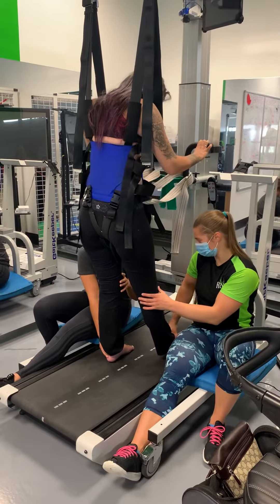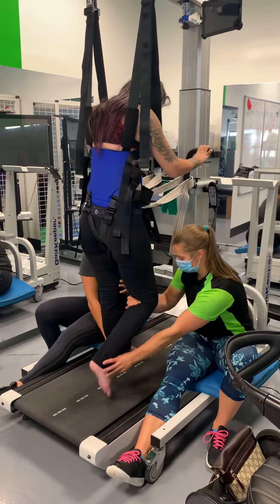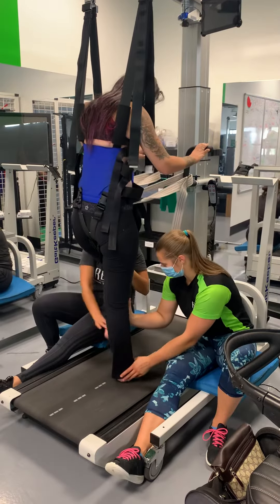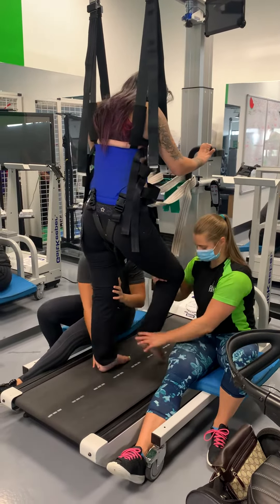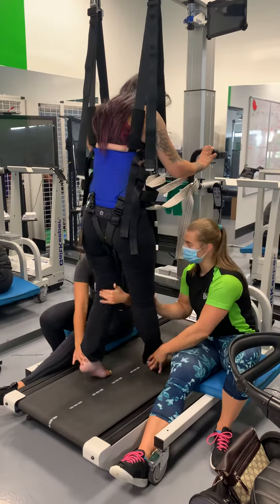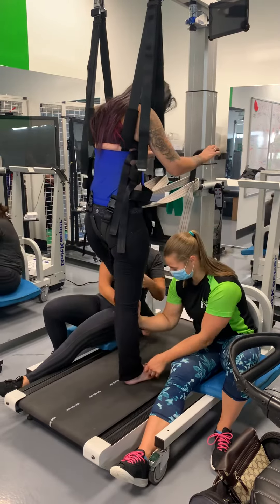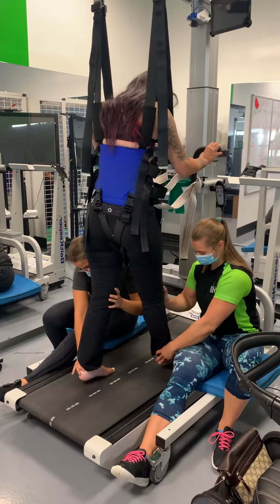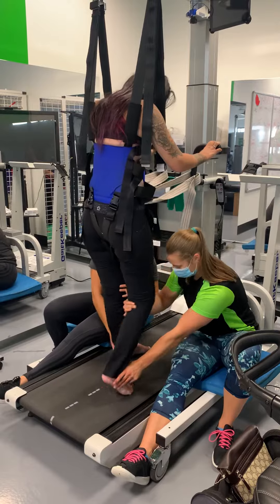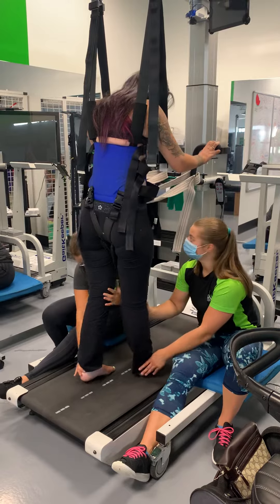So, slow — you're going to push it first and pick it up. There you go. She should be fairly easy. How are you doing up there? Stand up. Yeah, natural. Did this work so twice before? Thank you. There you go. Bring out the ball rim. Put onto the ball. Nice.